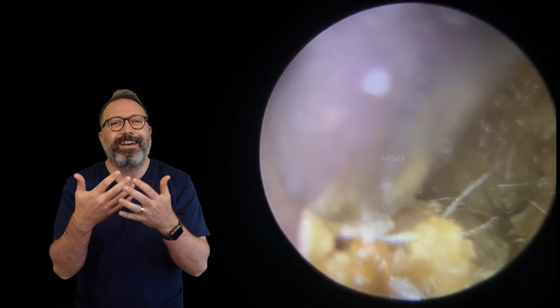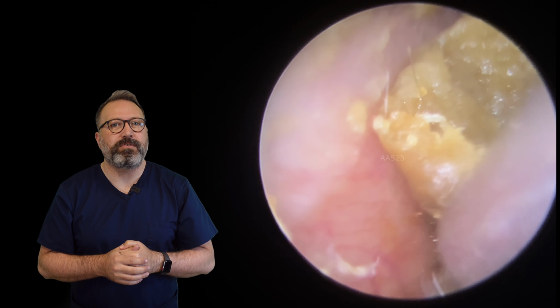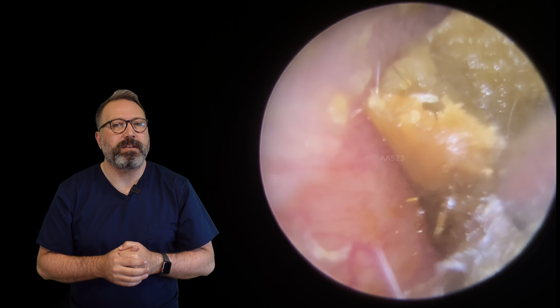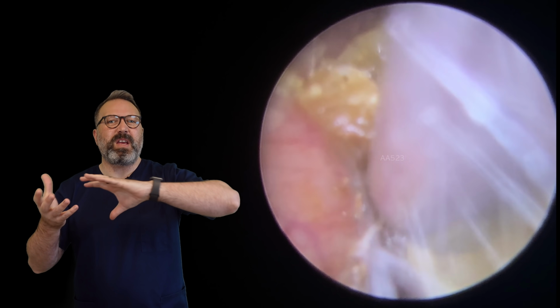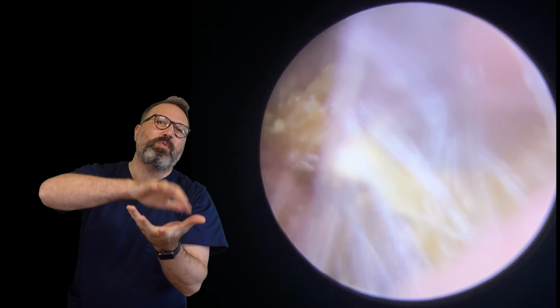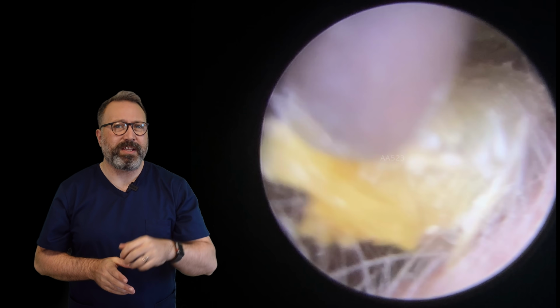Quite thick. It's quite dense, the cilia there. So we just got past those now, so we can work that a little bit deeper in, so we can get past those cilia now. You can see as we're lifting from the canal, see how it doesn't sort of come away, it more sort of folds backwards on itself. And you'll get these long strips of dry skin. That's what we're working on here.